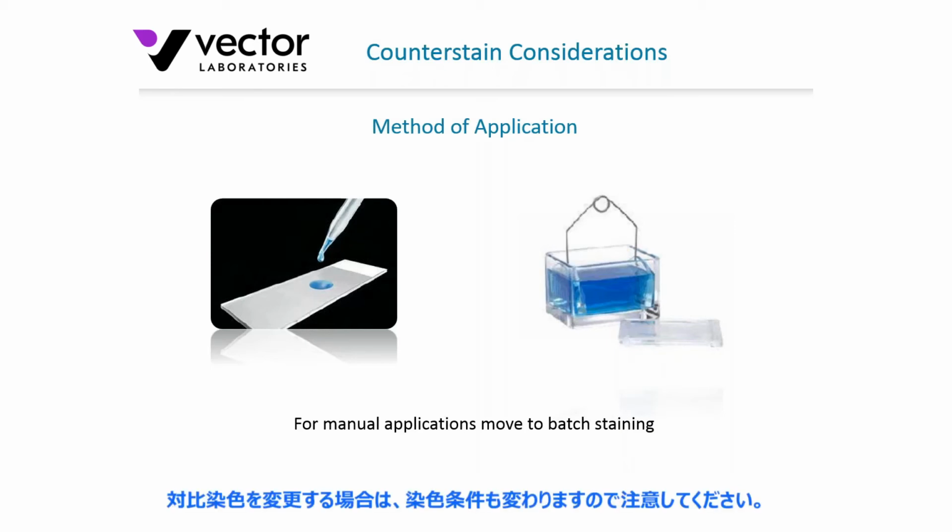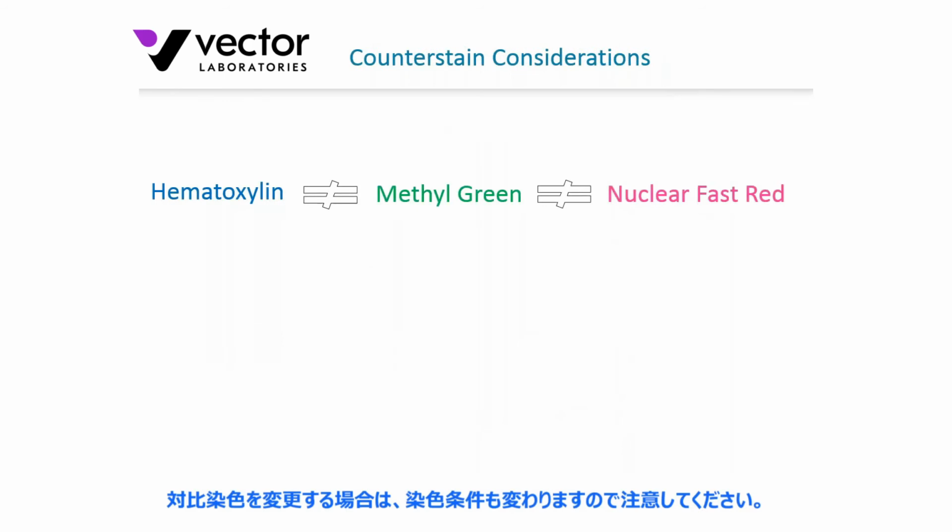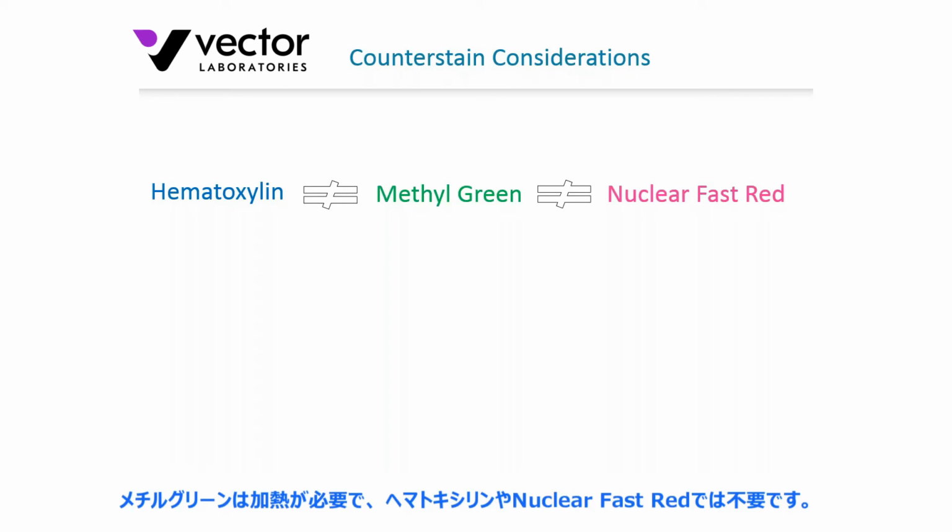Just be aware of the fact that if you are changing between counterstains, you want to mix it up. Not all of them are the same. As I've just mentioned, methyl green requires heating. That's not a requirement of hematoxylin or nuclear fast red. So again, don't expect methyl green to look or behave exactly the same as hematoxylin or fast red.